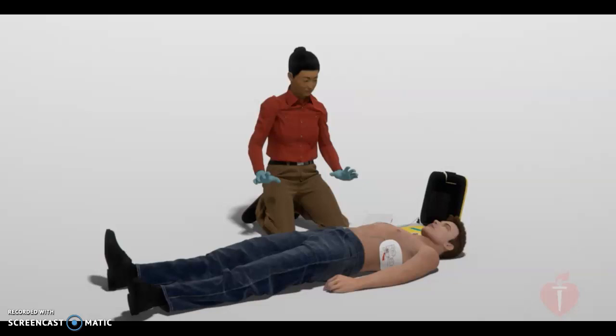The DVD will now pause for you to practice with an AED trainer. And don't worry, it can't really give a shock.